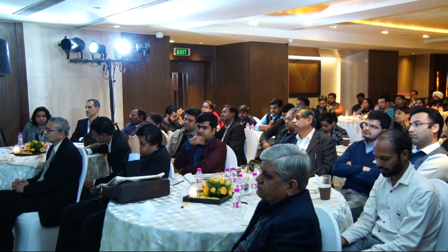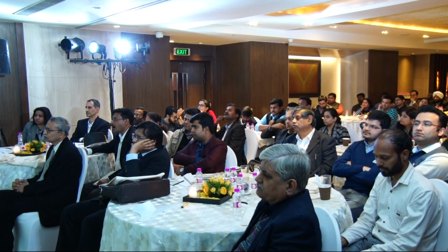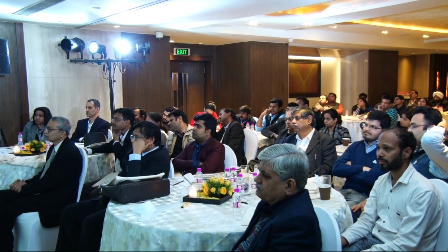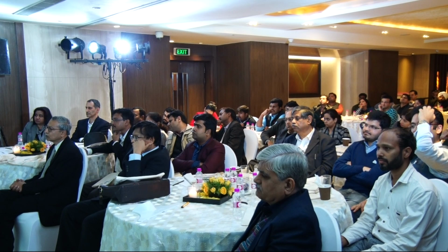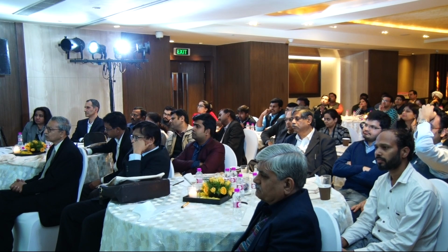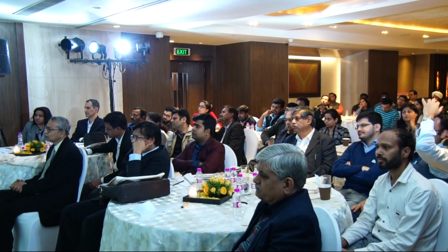So if you go to the next slide, slide 13, another example of that is plan-specific tolerances. What you see here on the left is a graph of an SRS patient-specific QA on an anthropomorphic phantom, and on the right is the actual trace of that patient's delivery. You can see there's some interesting correlations between the phantom plan and the patient-specific delivery in blue there on the right.